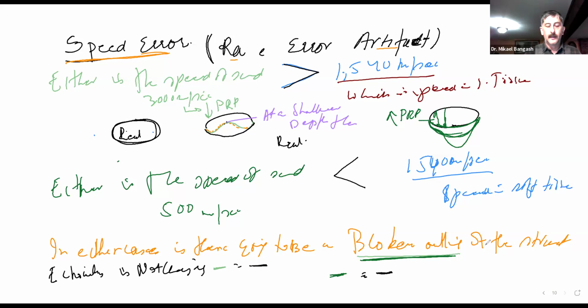Clear? Now the intensity of this reflection is not going to be stronger or weaker than what would have been produced by this boundary. Like right here, the intensity of your artifact, although it may appear slightly deeper, is not going to be stronger or weaker than the actual reflection produced by the boundary itself.